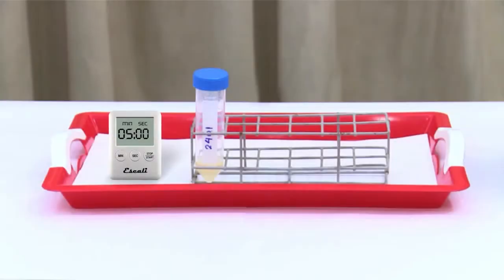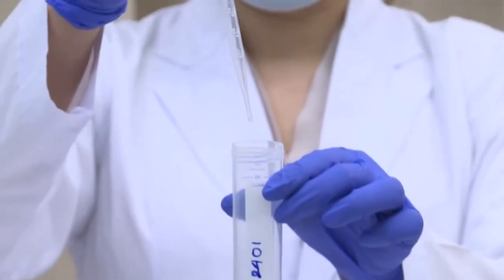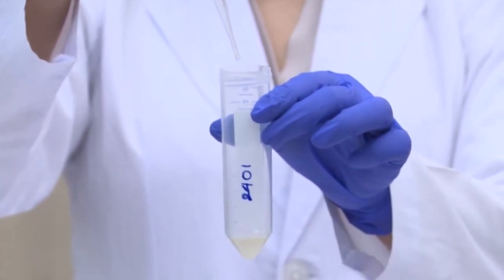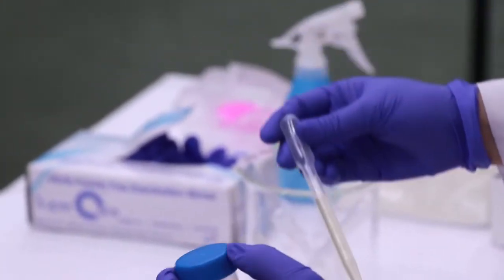Label the Xpert MTB-RIF test cartridge with the sample ID by writing on the left or right side of the cartridge. Using the sterile transfer pipette provided with the kit, aspirate the liquified sample reagent mixture into the transfer pipette until the meniscus is above the minimum mark, at least 2 mL.